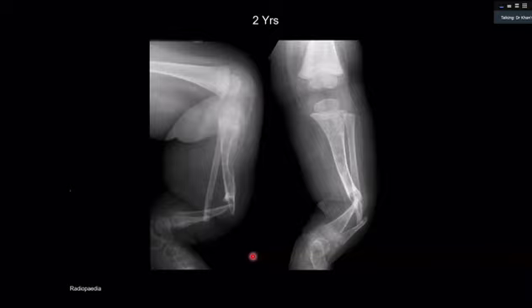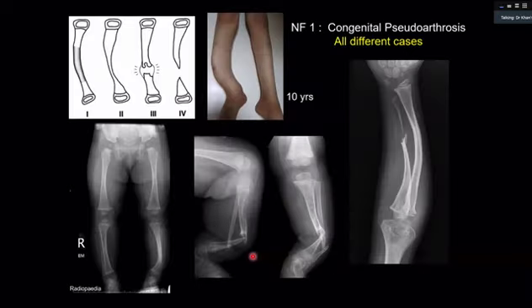Okay. So let me first of all go through it, and then you will understand what happens. This case is an extremely important case because if you know it, you will immediately grab it. If you don't know it, it becomes an absolute pain. Basically, in NF1, neurofibromatosis 1, this case can also come to you as a long case.